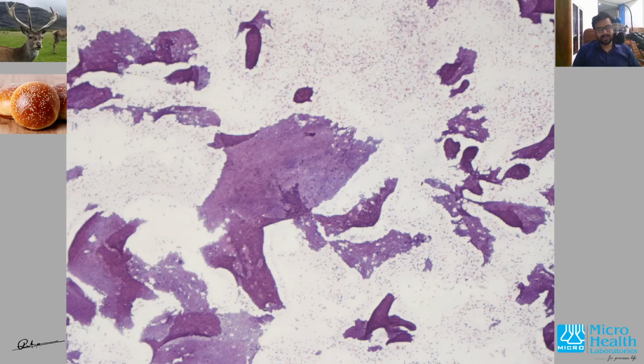Hey guys, here's another episode of Through a Pathologist's Eyes, and this is a case of a 20-some-year-old female who had a breast lump which concerned her, and she went to a surgeon to get it inspected. On palpation, he found it to be a very well circumscribed and firm swelling, and it was very much mobile and not attached to the skin surface or anything.